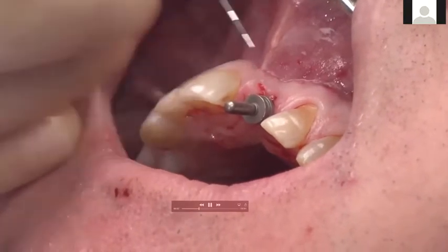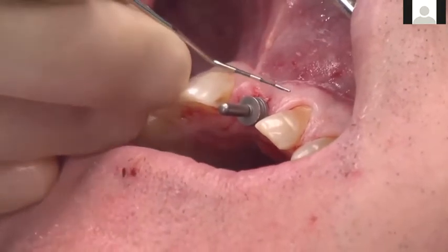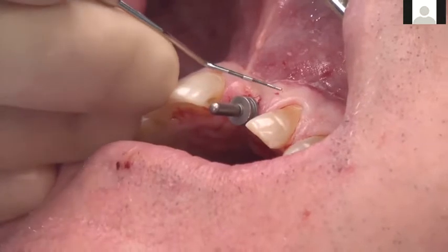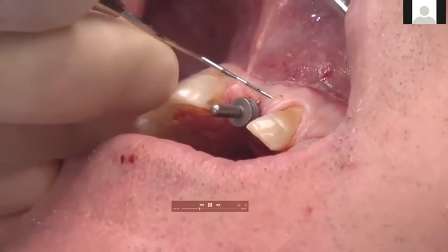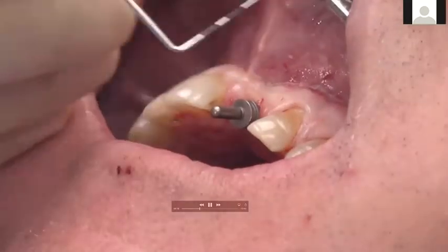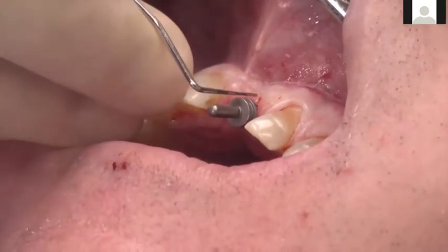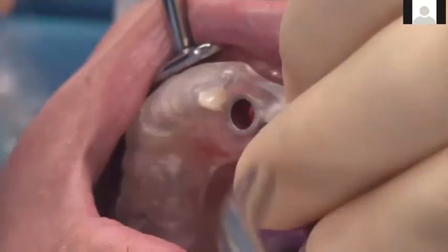But if I go ahead and put the probe exactly at the gingival margin of the contralateral central, you can see and mark it, kind of press on it, you can see we have a line here, right here. And from this line to our current gingival margin, it's probably about 1.5 to 2 millimeters, as you can see in this measurement. So that needs to be taken into account, how deep you place your implant.